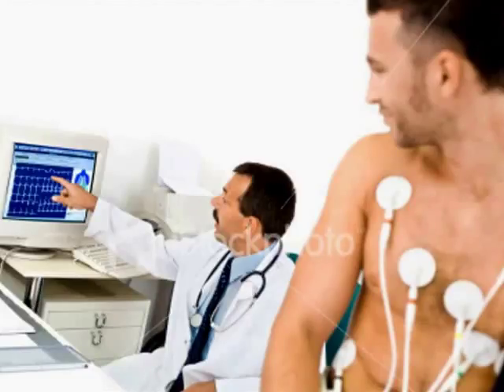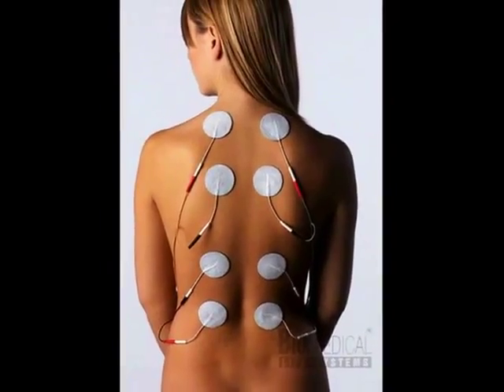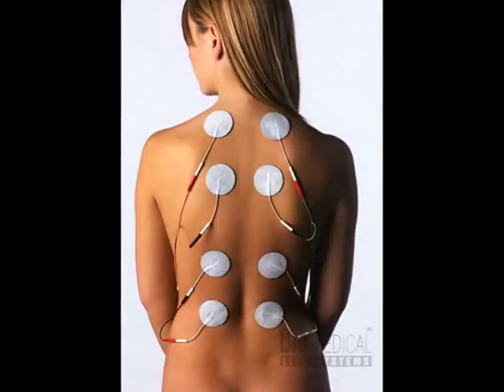So, since we covered that aspect, now let's talk about electrodes. Electrodes refer to the paper, plastic or metal device that contains conductive media and is applied to the patient's skin. These electrodes are applied at specific locations on the patient's chest wall and extremities to view the heart's electrical activity from different angles and different planes. There are 3 types of electrodes. You have metal disc, metal suction cups, and disposable disc. These remove oil and dead cells from the patient's skin and are then applied on the chest.